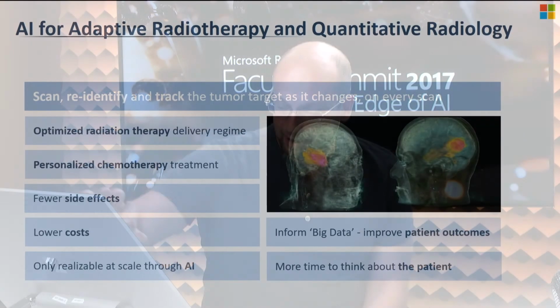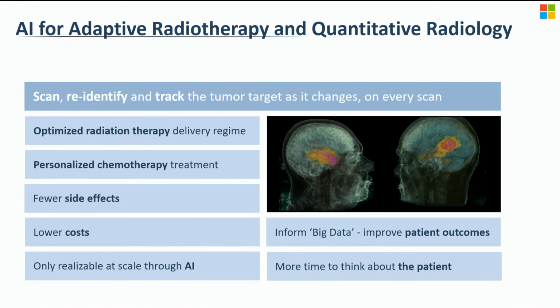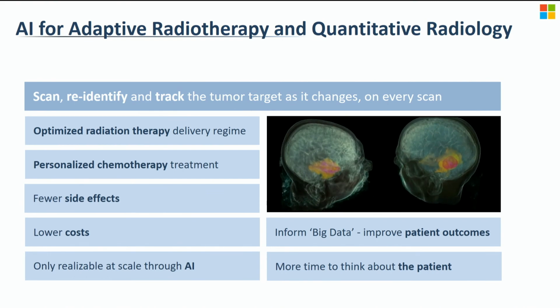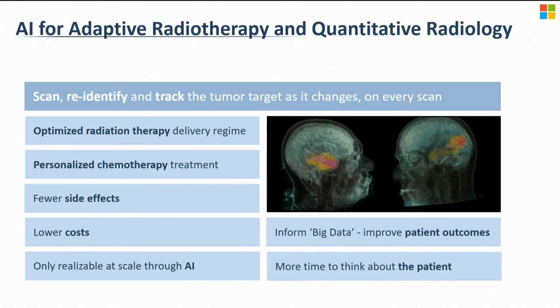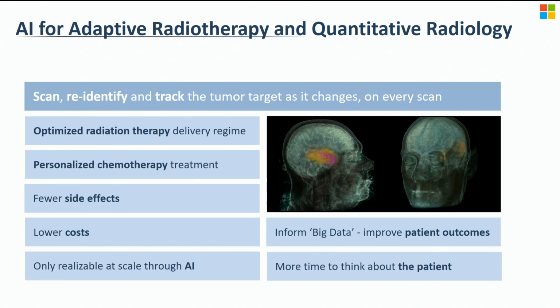So this is amazing stuff. Just to finish up, what's next for Project InnerEye? There are plenty of things that this kind of technology can unlock. There is this whole field of quantitative radiology, and surprisingly, this whole medical imaging area has been underserved by AI. There aren't really good tools that help physicians become better and help them spend more time with patients.